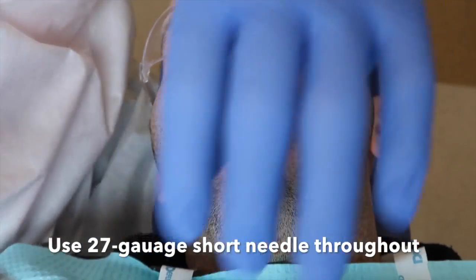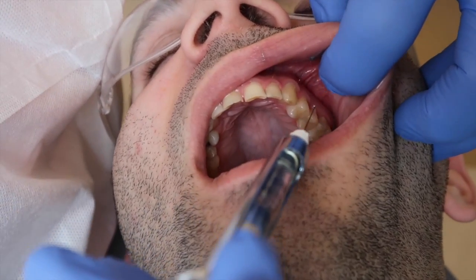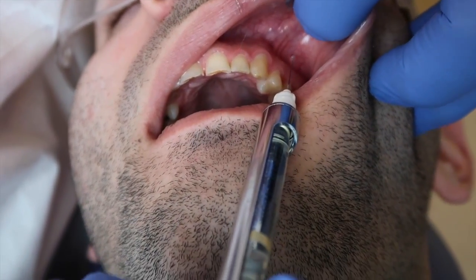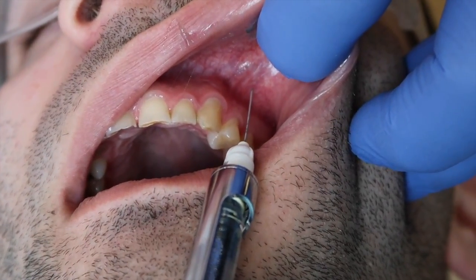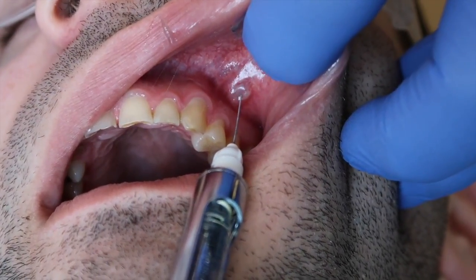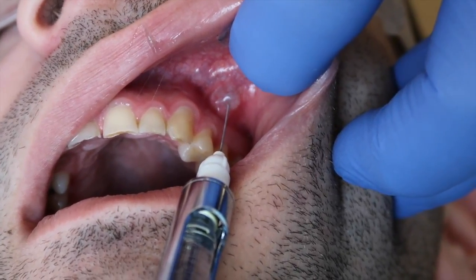In this case the bevel is not quite as critical, but following my usual methodology I'm going to have the patient close a little bit. Now I'm going to put some tension on that tissue so that I can barely — and I mean barely — put that bevel in. See how that tissue immediately bulges up. We have them. This is going to be a painless injection.